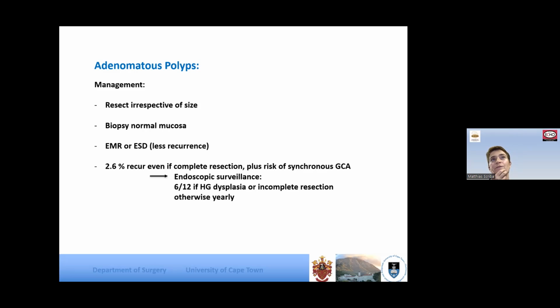And then in the duodenum, I think you need a very nice, happy looking adenoma to be performing an EMR or any endoscopic resection, because with an ESD in the duodenum, the perforation rate is pretty high. So I'd be careful there. I would probably go an EMR route. Remember here, it's very important to lift that thing.